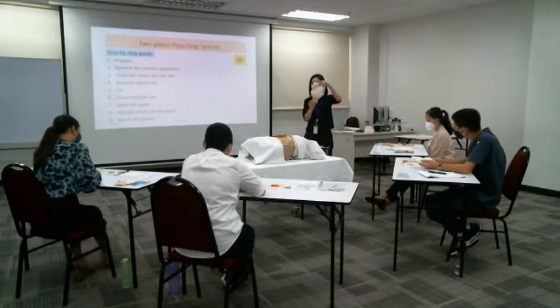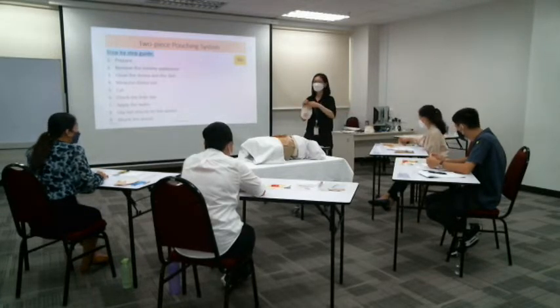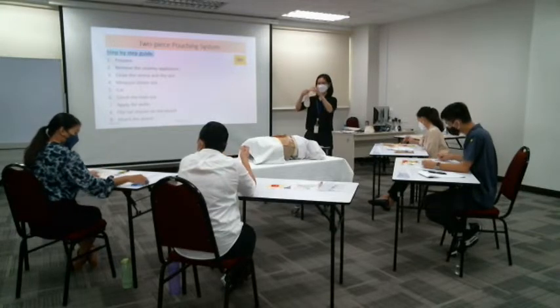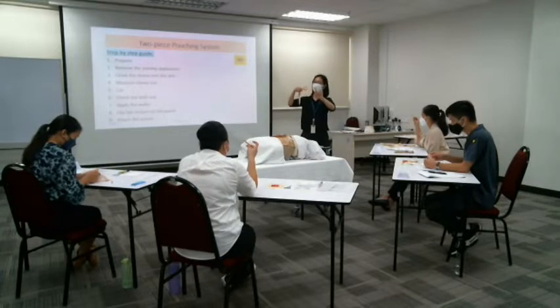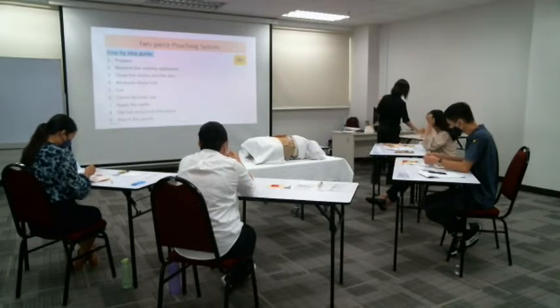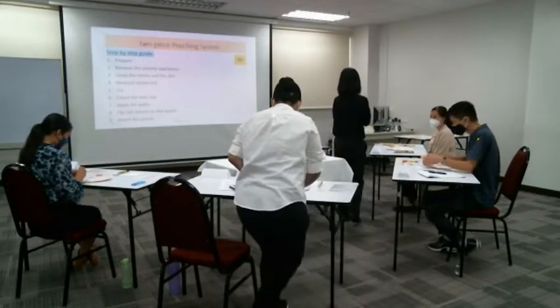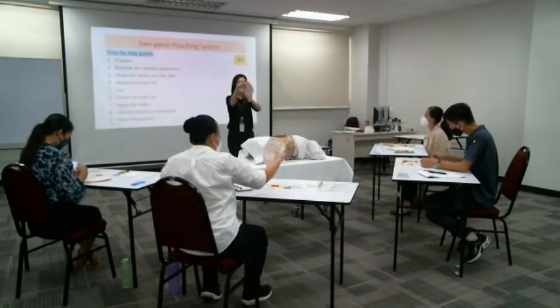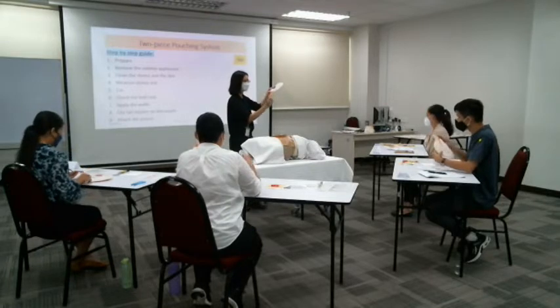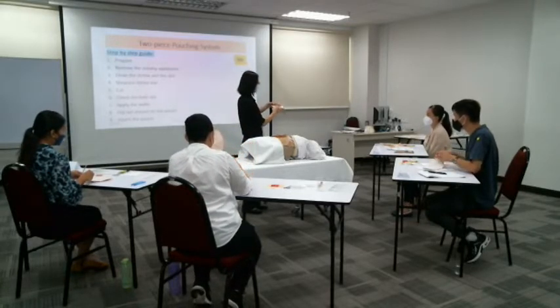The next thing that you are going to practice is using the clamp. You have two types of clamp, or two types of tail closure, on your table. One is the straight shape. Another one is the curved shape. If this is already on the patient, it will be like this. You are going to open up the tail closure here, and after that, put it in this way and close it one layer.